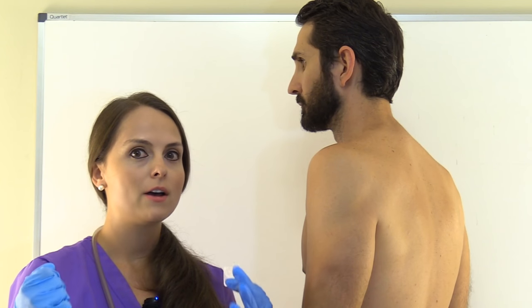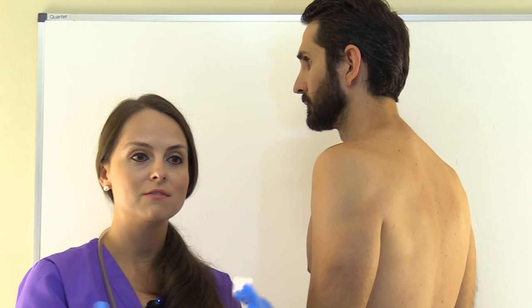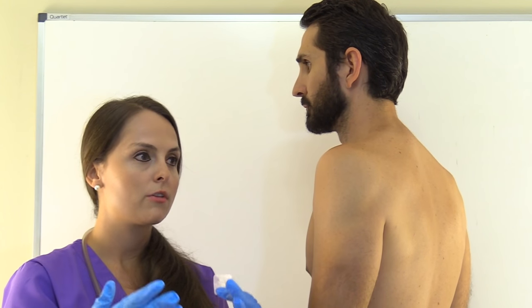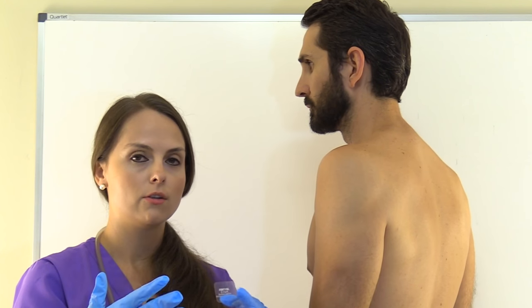Another tip: if your patient is confused, don't put the patch somewhere they can grab it off. If it gets lost and a child or visitor picks it up not knowing what it is, they could get fentanyl on them. Put it somewhere they won't pick it off, and try to choose an area that won't have a lot of friction or where it would easily come off.